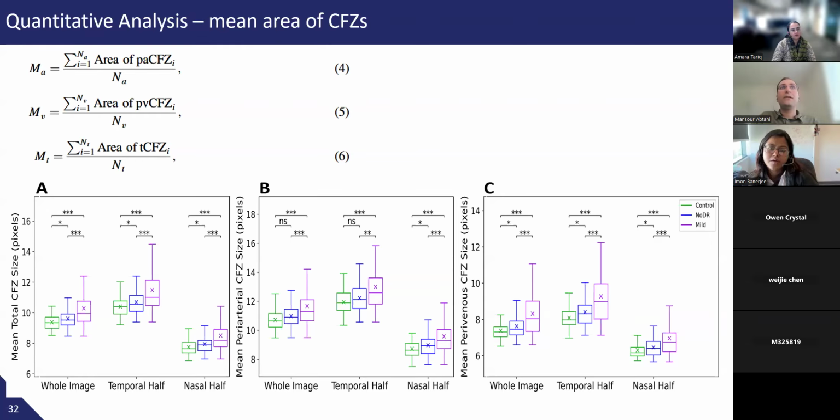And also we can do longitudinal analysis. When we extract quantitative features for a patient, for example, from 3 months ago, we can compare that with the current image that we are taking. We can compare them to see whether the situation is better or worse. And if we have any kind of treatment, any kind of prevention, we can understand the effect of them on the quantitative features.